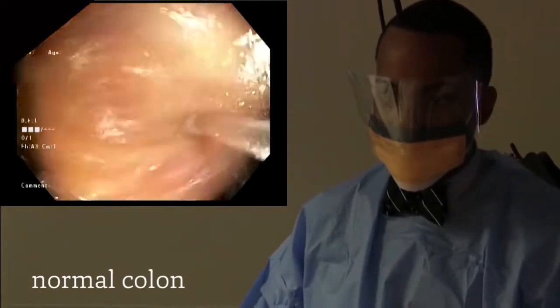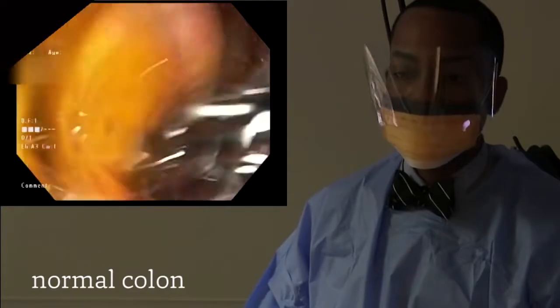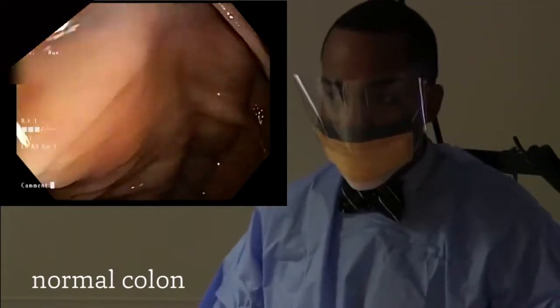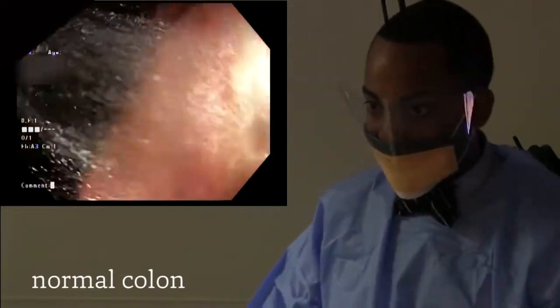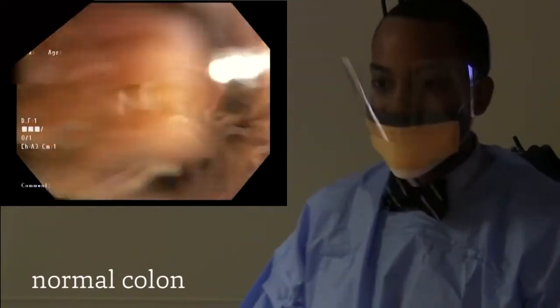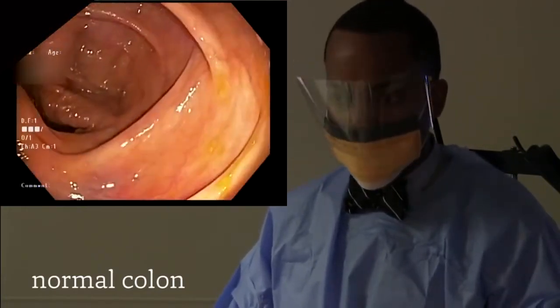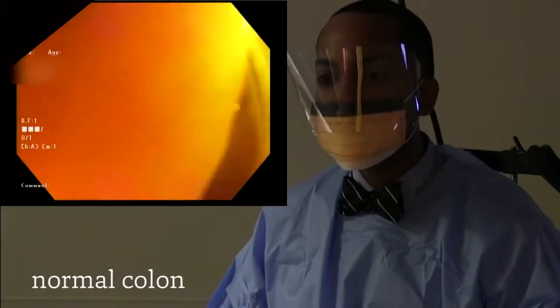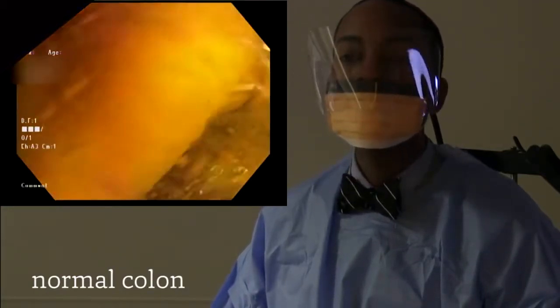During this part of the examination, called the inspection, we slowly withdraw, being careful to examine the colonic mucosa in a clockwise fashion. It doesn't necessarily have to be clockwise, but we need to ensure a 360-degree view of the colonic wall. We use water to wash away any stool or sediment, and we can use suctioning to withdraw that liquid.